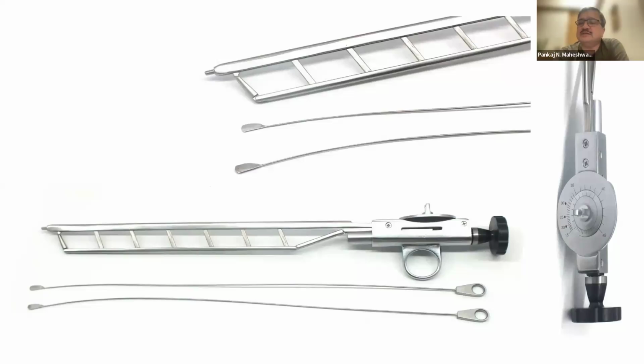What is the advantage of using this equipment? Advantage and disadvantage? So the advantage is that in cases of narrow urethra, it can help us to create a desired lumen size based on the procedure we are wanting to perform. And it can cause false passages if not inserted carefully. It can damage the urethral mucosa and can create a false passage. Trauma and bleeding are the two probable disadvantages.